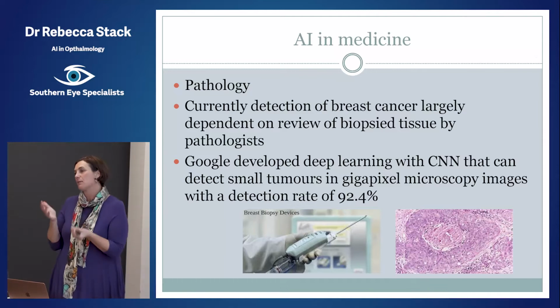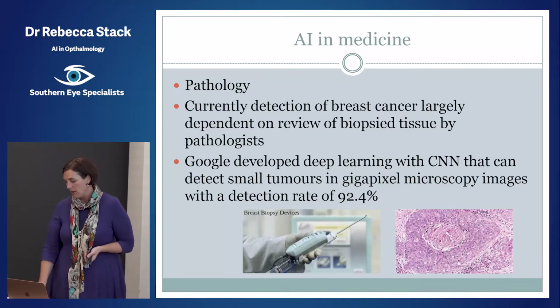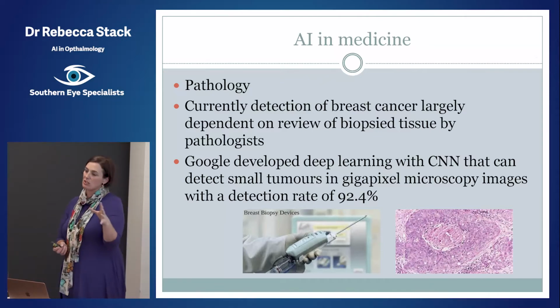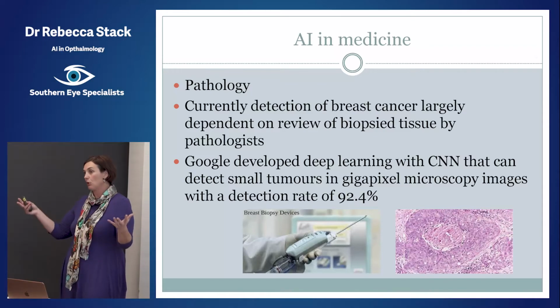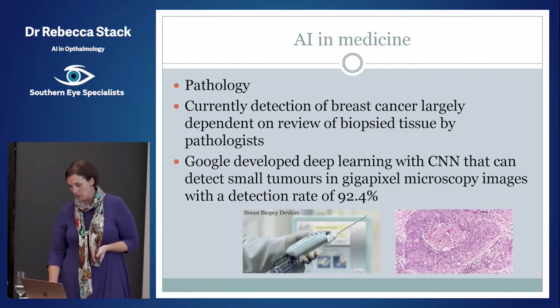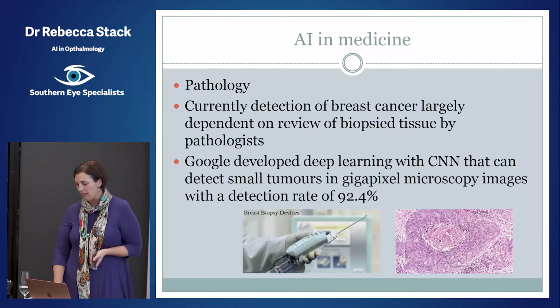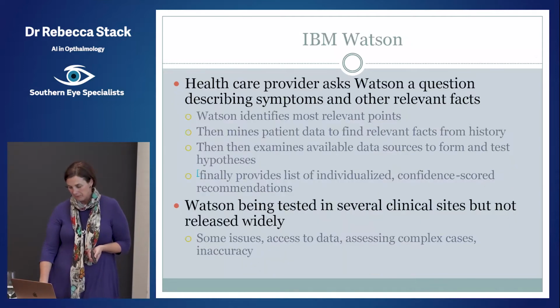However, when you compare that to pathologists looking at it, there's not that much difference between them. So you can imagine the implications if you can still have a whole lot of people that can take biopsies, but they can then take a photograph of them and a computer program can tell you whether it's right or not. That's a big chunk of the workforce that we don't need anymore. Much more accessible for people to get the answers they need for things like a biopsy.